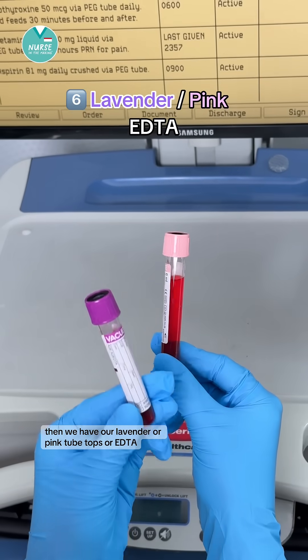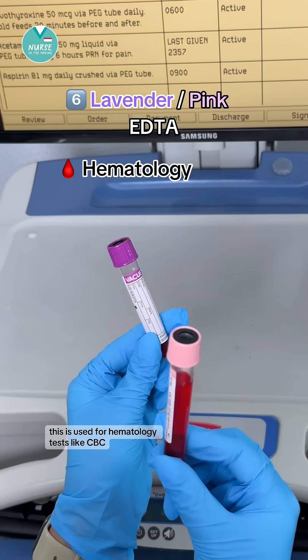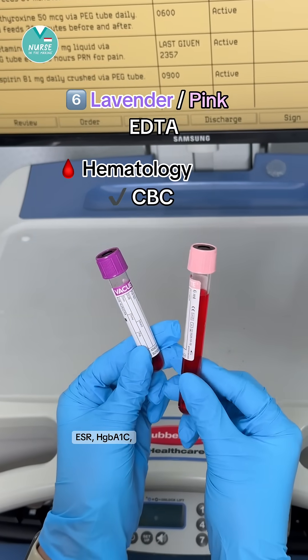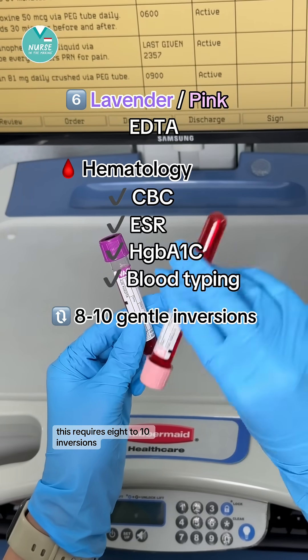Then we have our lavender or pink tube tops, also known as EDTA. This is used for hematology — tests like CBC, ESR, HbA1c, and blood typing. This requires eight to ten inversions.